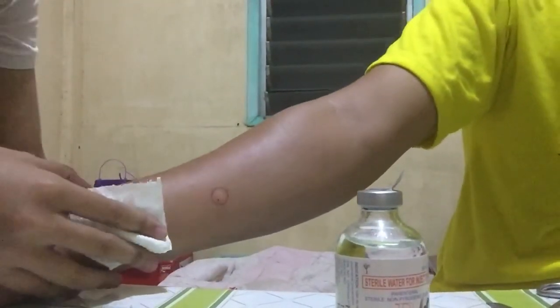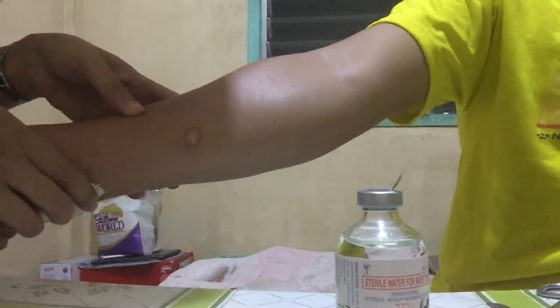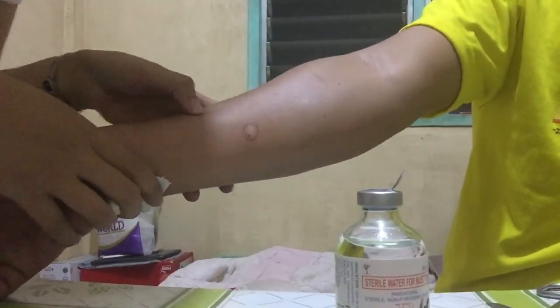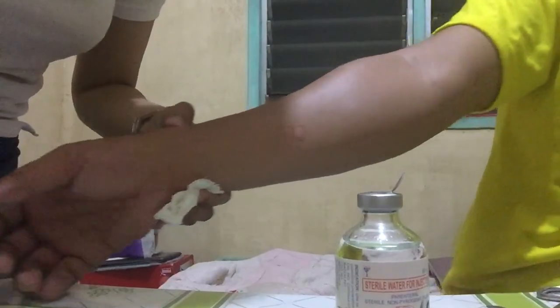If the redness does not go beyond the boundary, meaning you have no allergy, so it's okay to inject the medication. Wait for 30 minutes. This is a sample intradermal skin testing. Thank you so much.